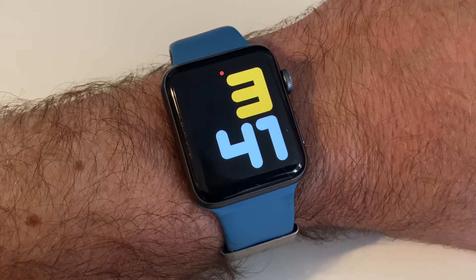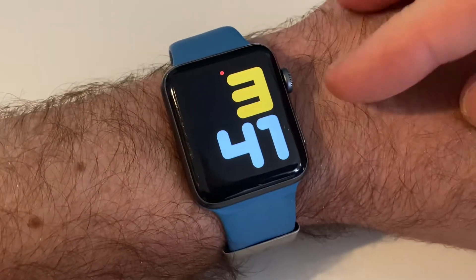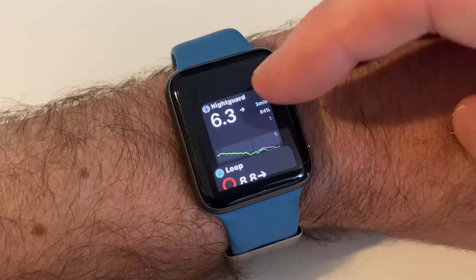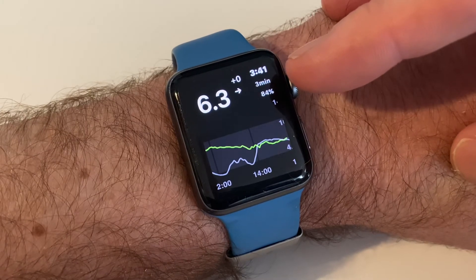So if you've got a CGM, such as the Freestyle Libre or Dexcom, and you're feeding data to Night Scout, you can basically then view your readings using an app called Night Guard, which is free and easy to install. And basically I can see the data from my Night Scout setup.